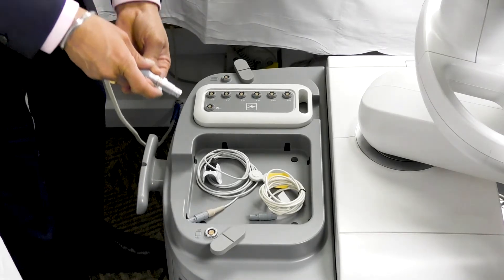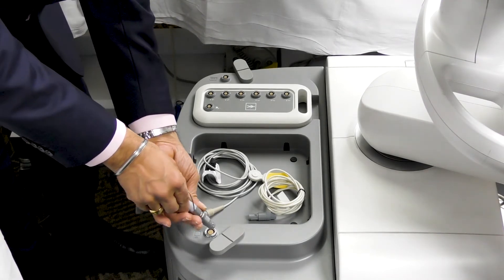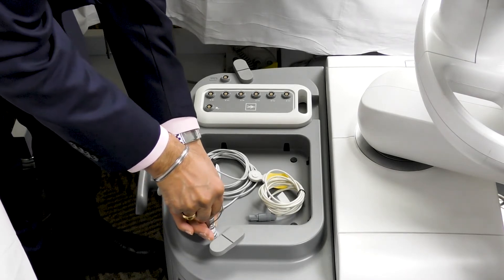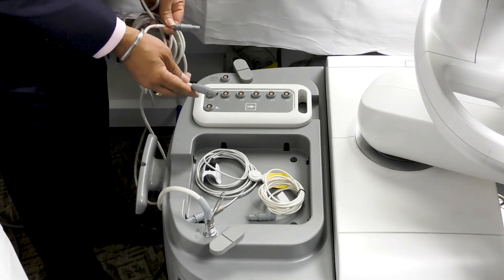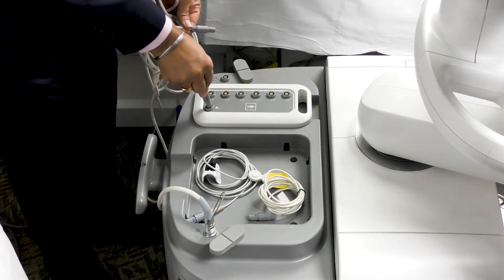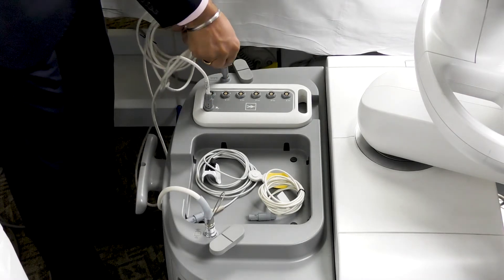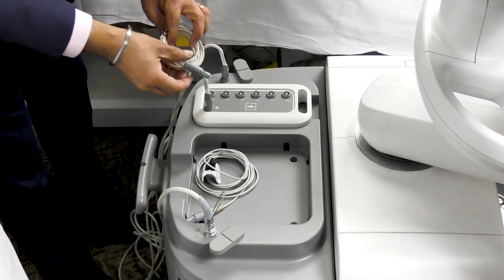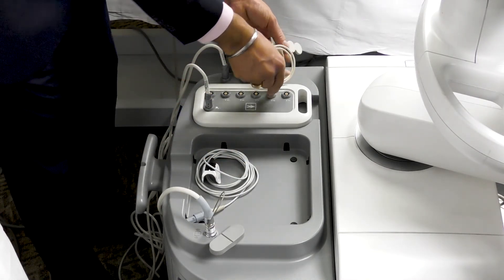Connect the field generator to the connection port on the rear side of the system. Align the red dot on the cable and the red dot on the connector. Also connect the tool connection unit to the system with the help of TCU cable. Plug in the patient tracker and the transducer tracker in the tool connection unit.